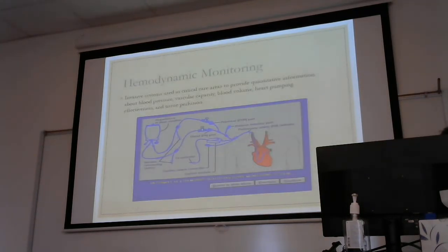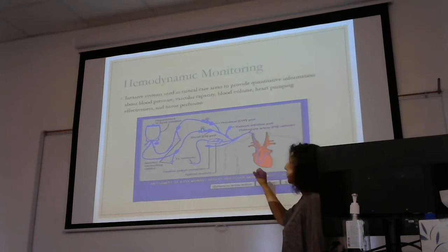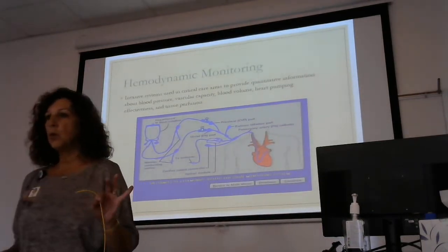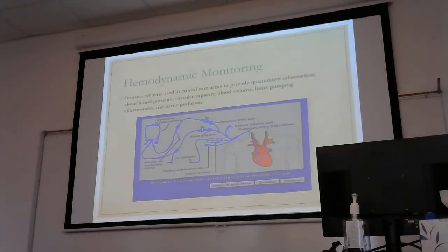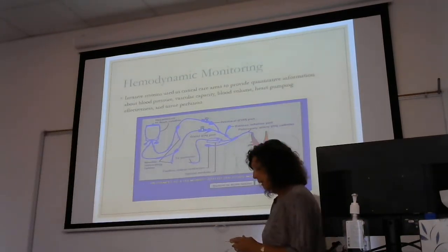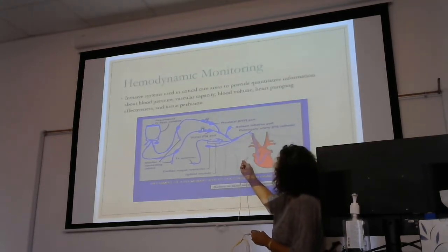Okay. All right, so you saw the terminal end of the catheter was in the pulmonary artery. If we were ordered to do wedge pressures, and they were usually every 4 to 8 hours, they wanted you to wedge your balloon. So what that meant was this. We would inflate the balloon. I doubt it's going to do it because I think it's busted. Let's just see. Oh yeah, it's dead.